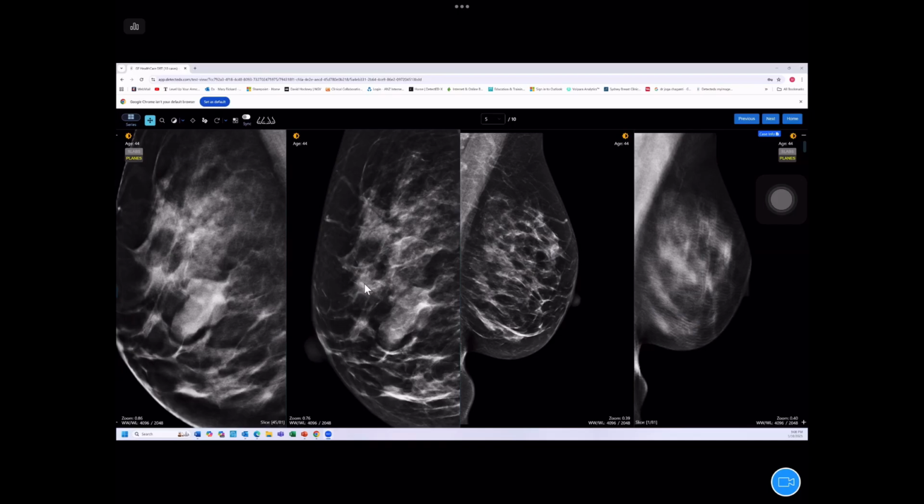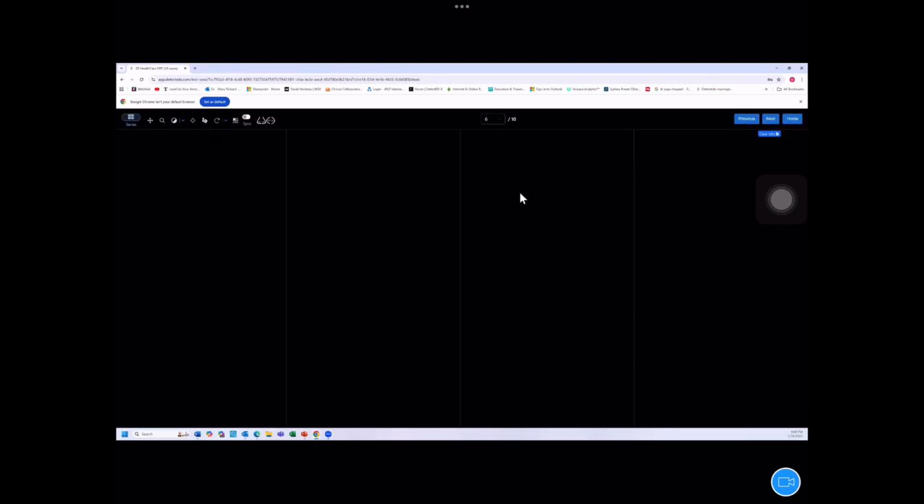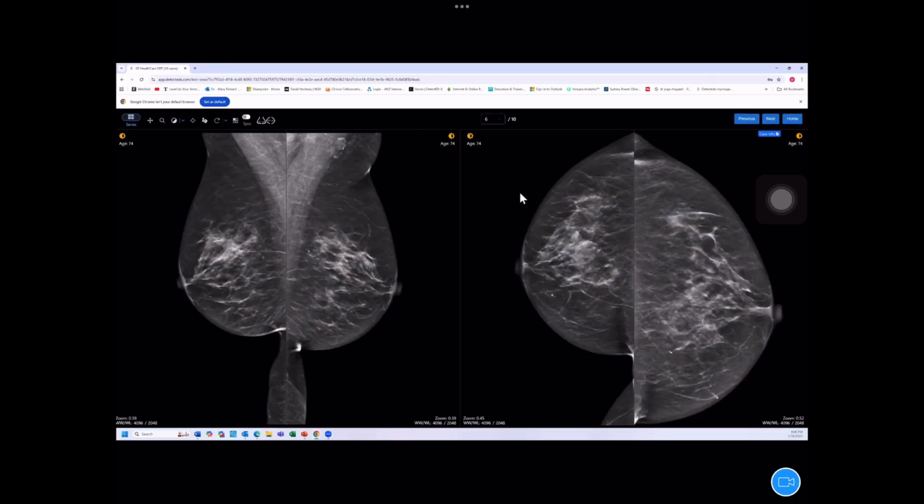But essentially, most soft tissue lesions that are benign don't actually have a greater density than the surrounding tissues, whereas malignant lesions tend to be denser because the cellular content is more concentrated spatially. Given it's a mass, this one looks much the same as the surrounding tissue, and it has very benign features. This is in fact a known fibroadenoma for this patient. Okay, we'll go on to the next case.